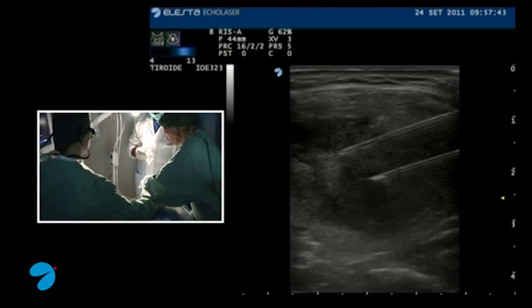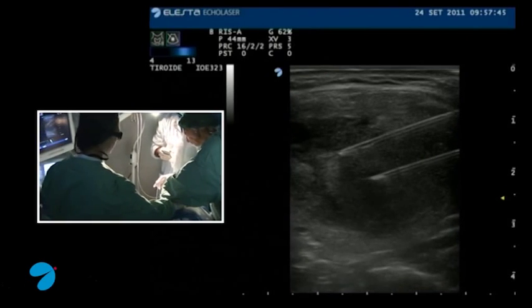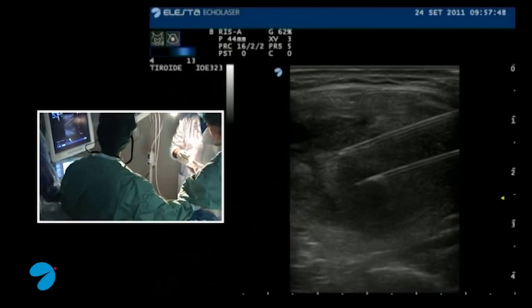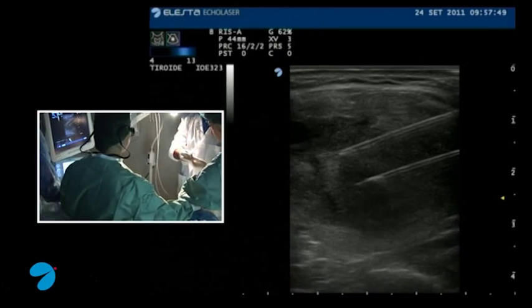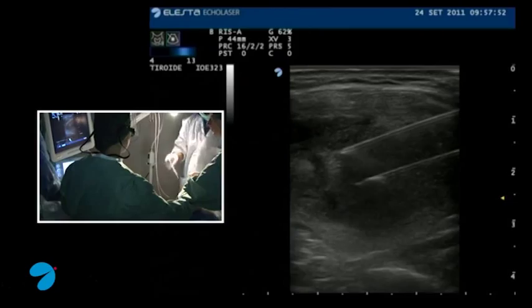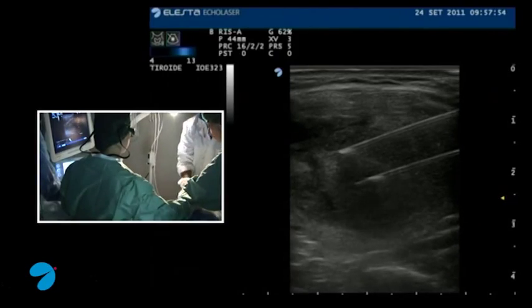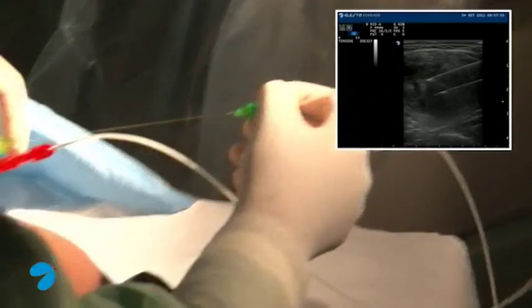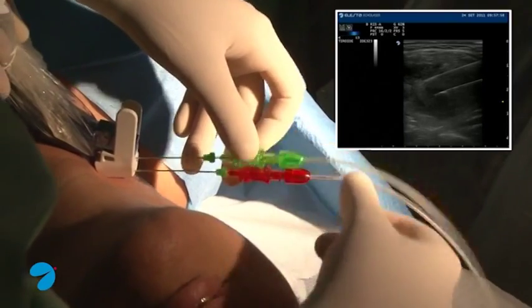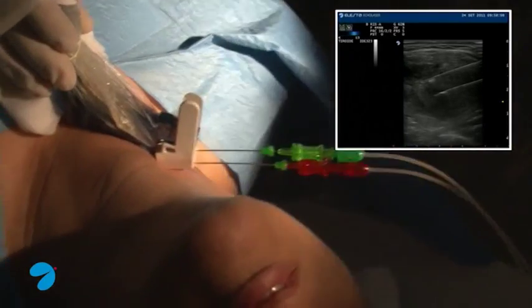We are now inserting optical fibers into the needles. We proceed to insert the first fiber in the lower needle and the second fiber in the upper needle. After the insertion, we evaluate the fiber tip position in the nodule.